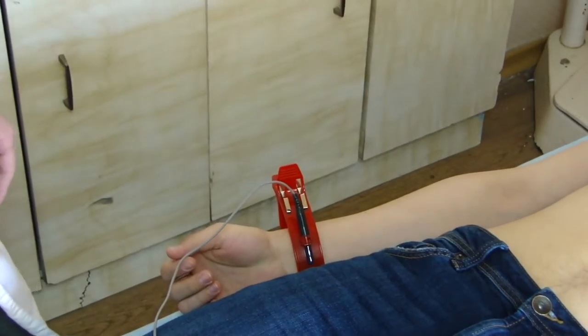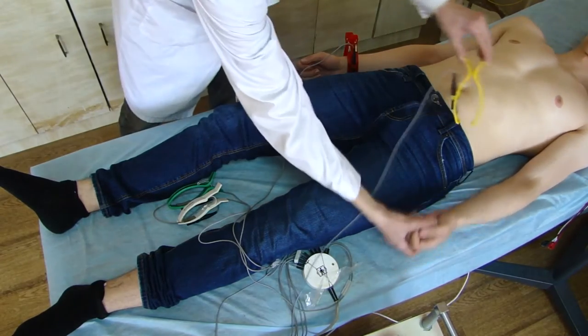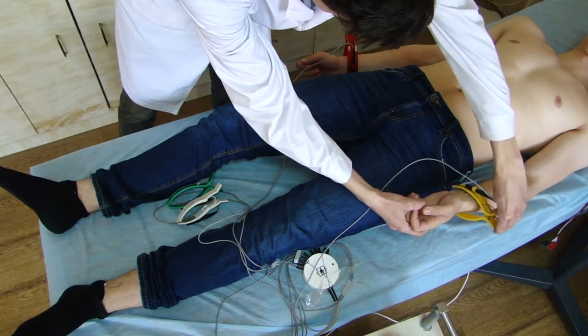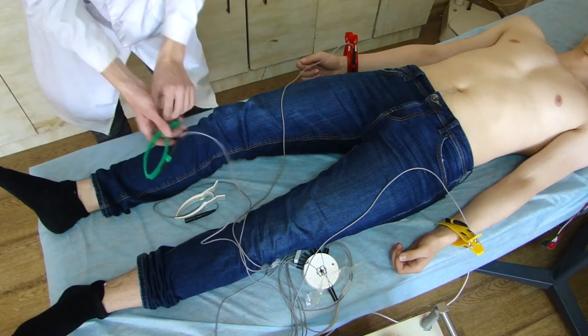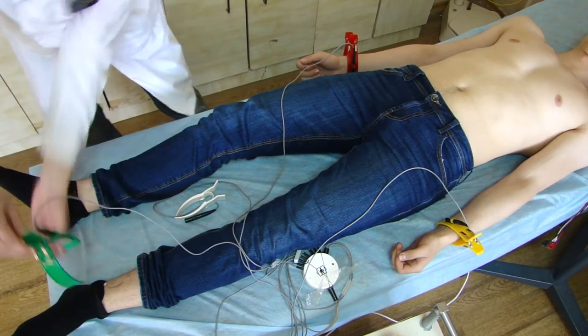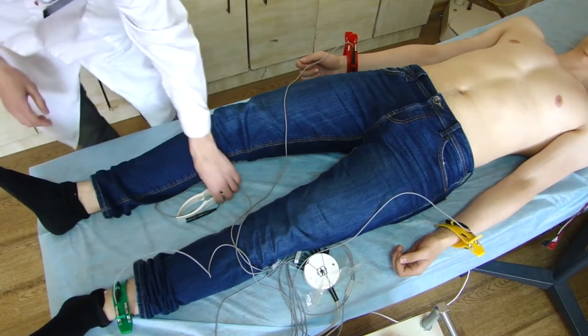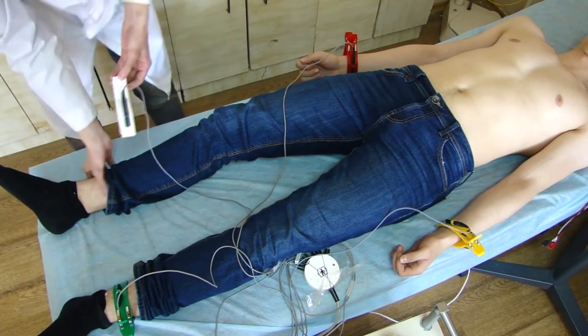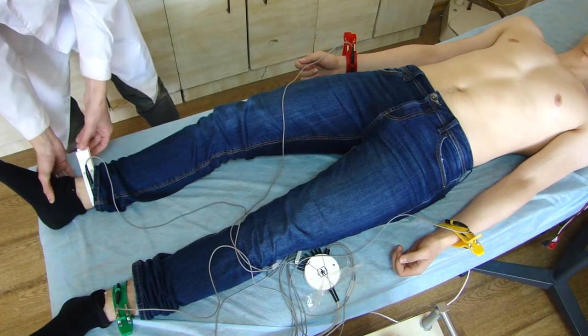Electrodes have a standard international coloration. The procedure for applying electrodes to the limbs: right hand – red electrode, left hand – yellow electrode, left leg – green electrode, and right leg – black electrode, which is the inactive ground electrode.